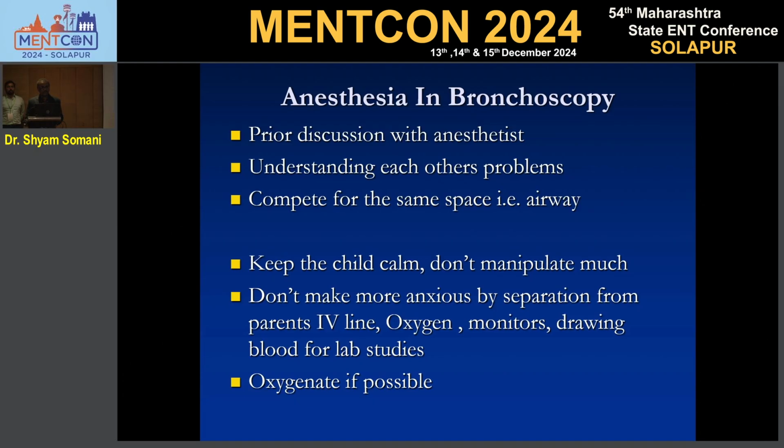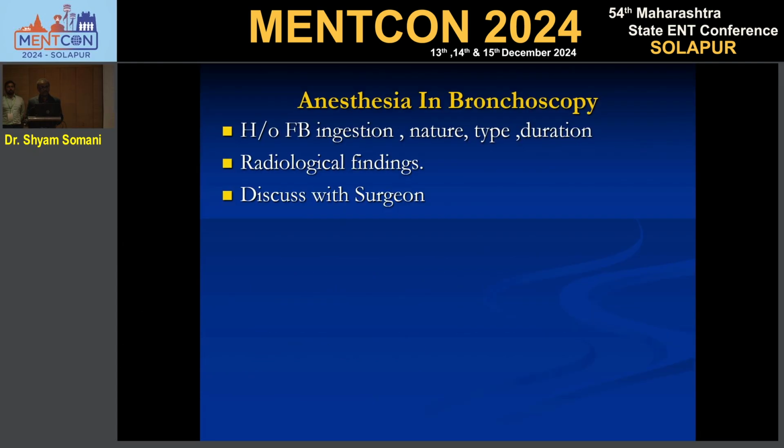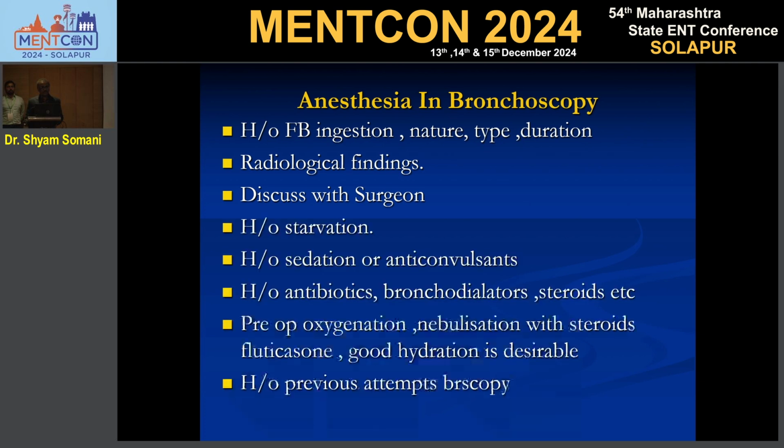Anesthesia is part and parcel of the procedure itself. We need to have a good discussion with the anesthetist, good rapport, because we are sharing the same space. And the anesthesiologist should know all these things beforehand, before coming and giving the anesthesia.